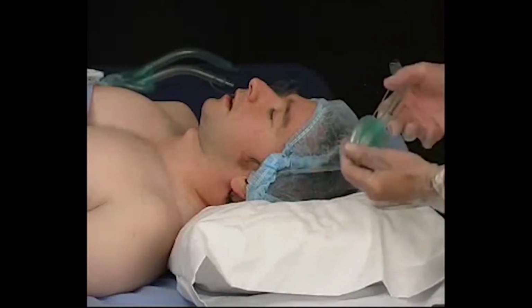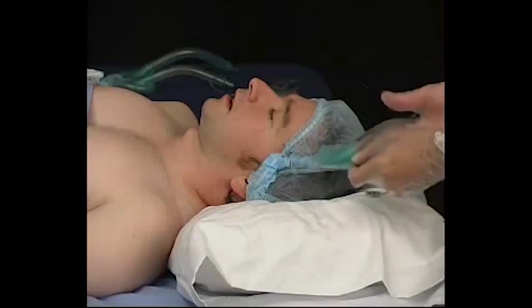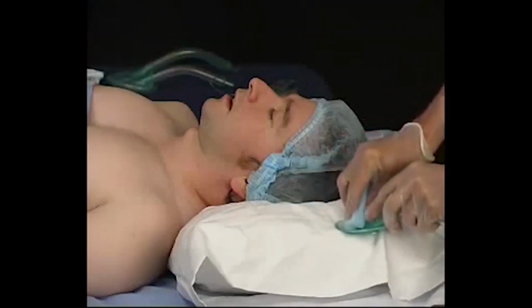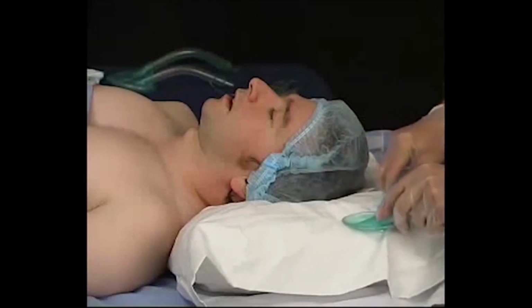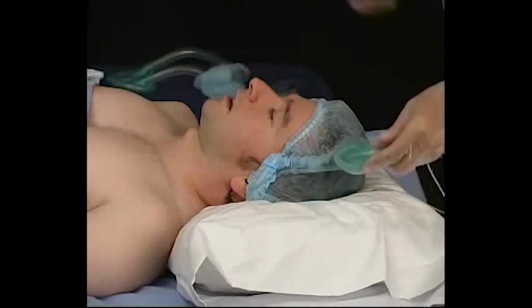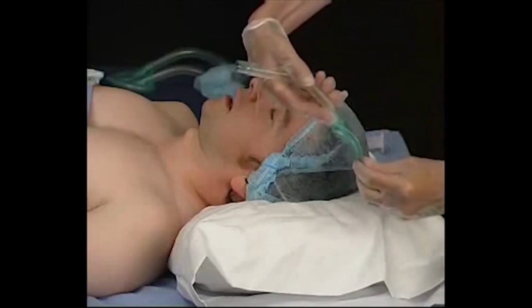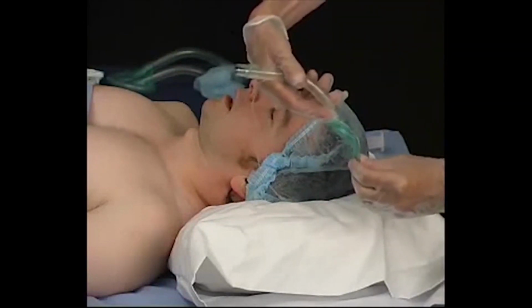Next, prepare the Solus for insertion by putting some gel or lubricant on the back of the cuff. Just on the tip of the backplate is all that is required. Then, in readiness for the correct insertion technique, insert your index finger into the slot formed behind the flattened cuff and the junction with the airway tube.